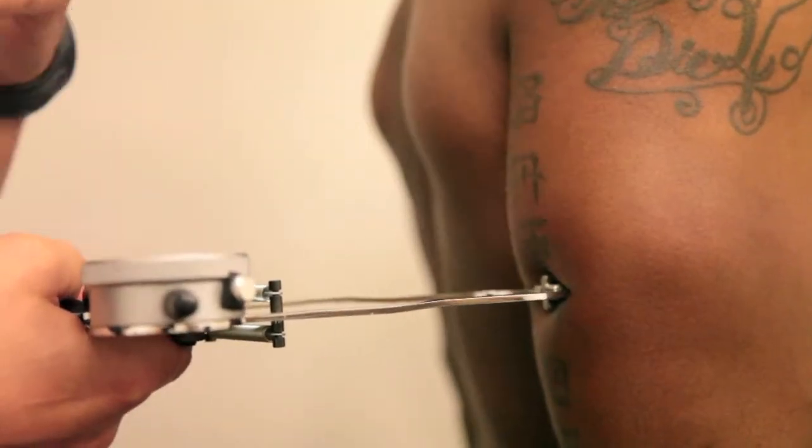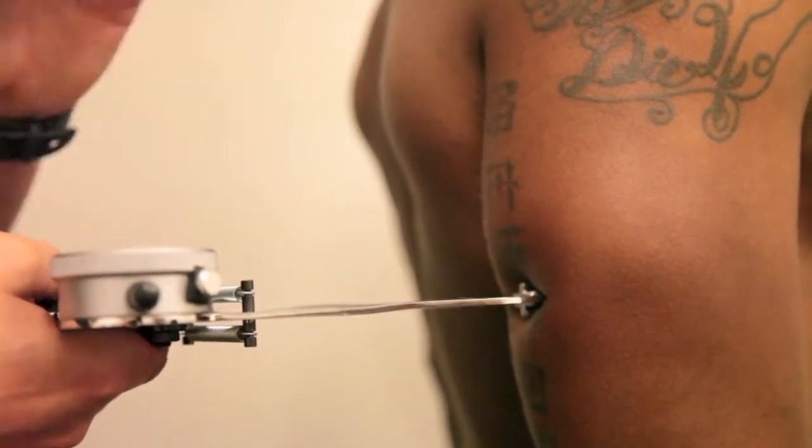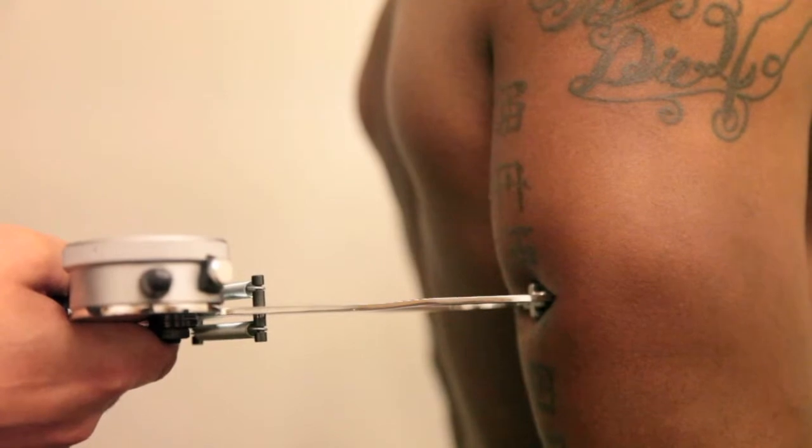If it helps, especially with people who are very muscular and it's difficult to separate muscle from fat, we can have them flex their arm by straightening their elbows.